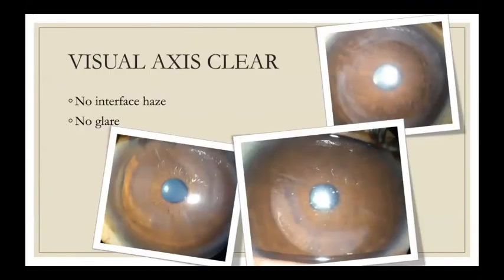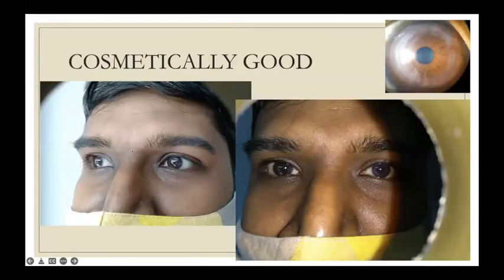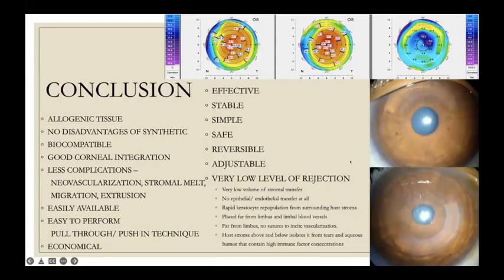There are a lot of other advantages as compared to other additive keratoplasty techniques, which also go over the visual axis, for example, SMILE lenticule implantation and so on. CAIRS does not cross the visual axis at all. It is untouched. So you do not have any opacification, haze, loss of contrast sensitivity, or anything that could interfere in the long run. There's no glare. CAIRS is in the mid periphery. It's cosmetically good looking. You cannot make out when you look at the patient.